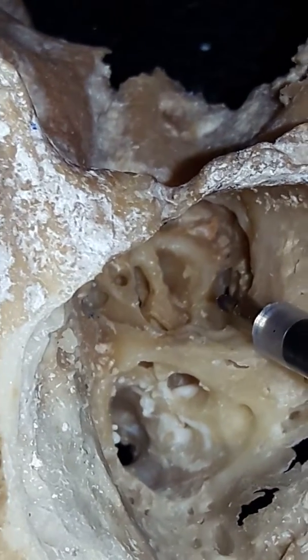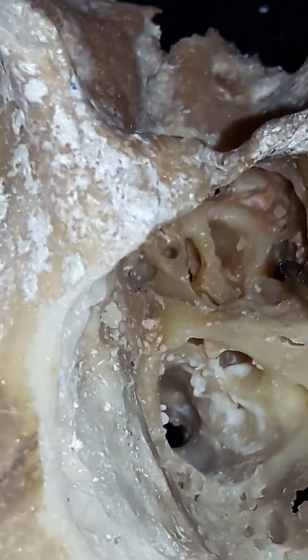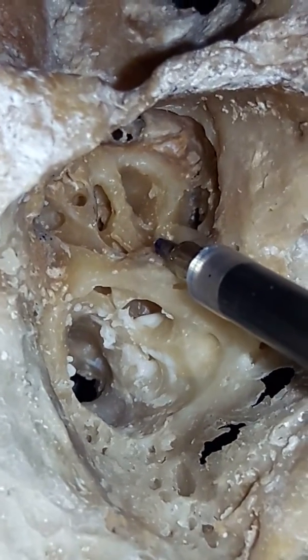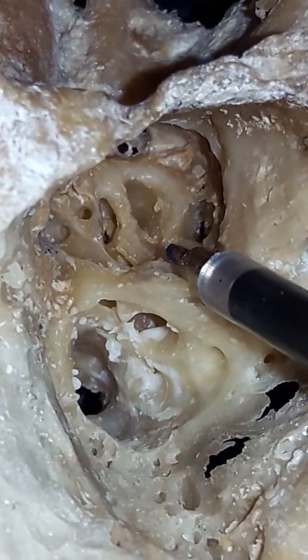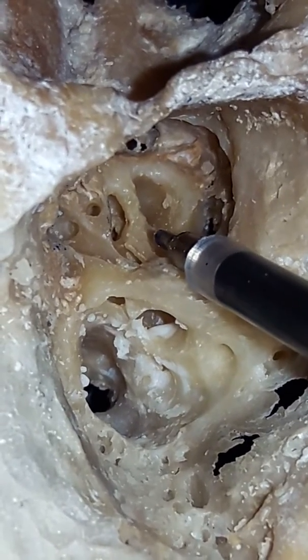There are so many case reports where the electrode is passed into the subcochlear tunnel. So how to avoid that? The only way is to identify the fustis. So we have to make a cochleostomy by staying above this fustis at the anterior-inferior area to the round window.